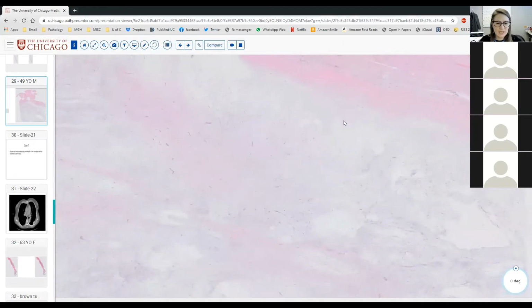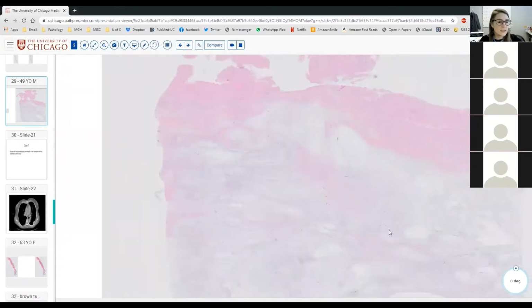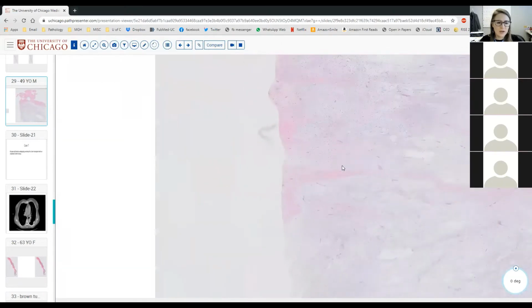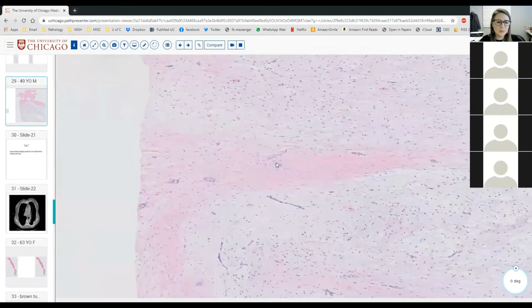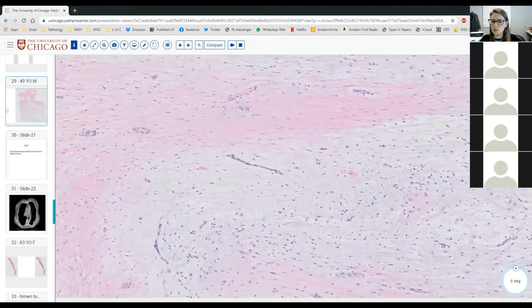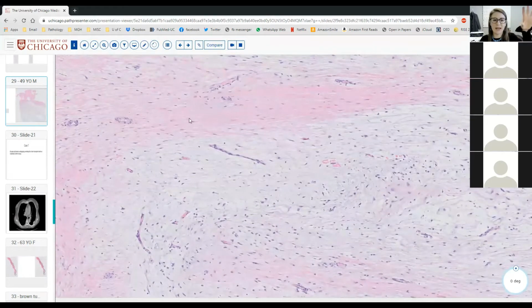What might be the one other tumor that we haven't talked about yet, now that we see the resection with occasional interspersed more fibrous, more pink bands? What is the one other diagnosis that we may want to exclude with this morphology that has both myxoid background and occasional fibrous septae or collagenous background, I should say?